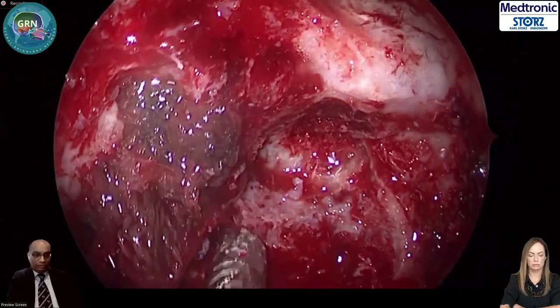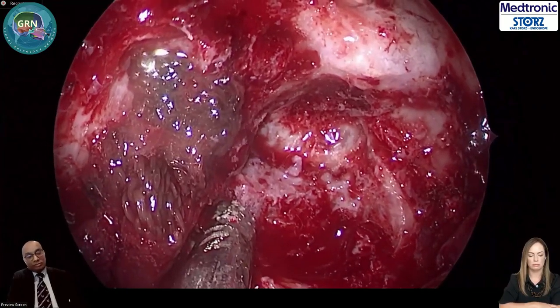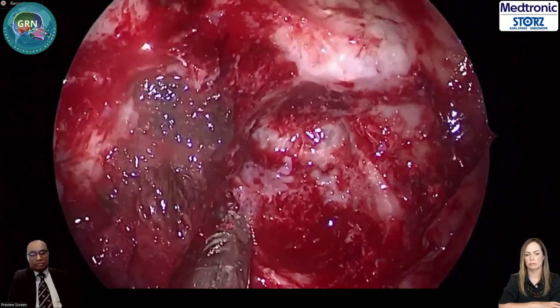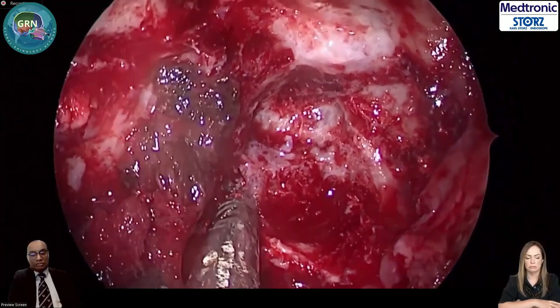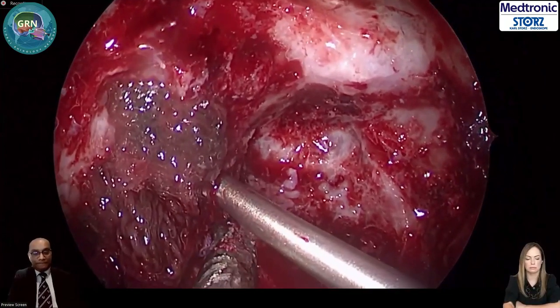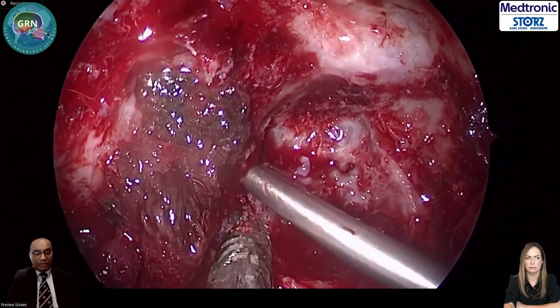Always, before you remove, you just check with a Doppler. Give me a Doppler. Whether that's the carotid or not, because there's some pulsations there. And then if you see, that part of the carotid is covered by periosteum. Can you hear it?